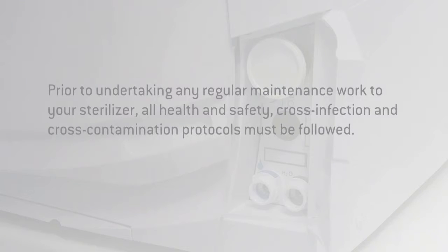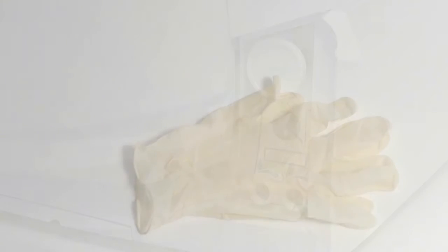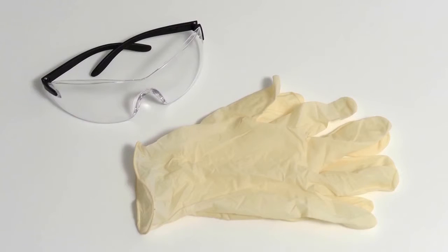Prior to undertaking any regular maintenance work to your steriliser, all health and safety, cross-infection and cross-contamination protocols must be followed. Gloves and safety goggles should be worn.